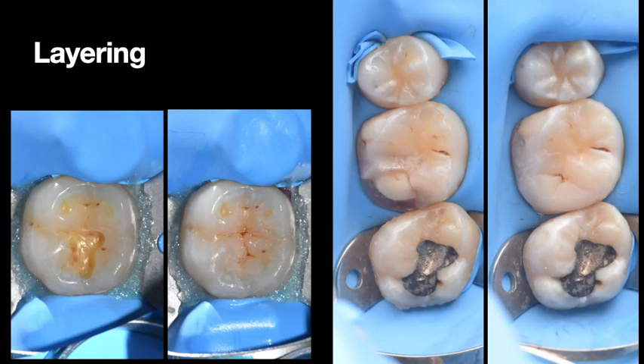However, in cases where we are doing layering of the tooth or cuspal buildup, there may be no excessive composite on any surface. Therefore, if this oxygen inhibition layer is not removed, it might be retained and turn the composite surface or the entire composite yellowish. It is recommended that whenever we use any layering technique, we remove this oxygen inhibition layer.